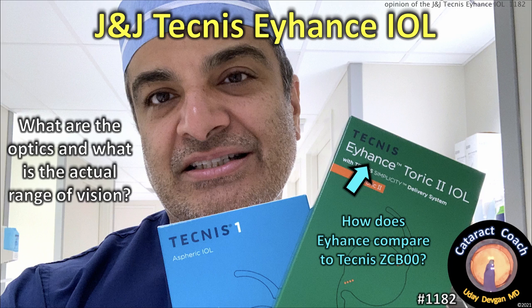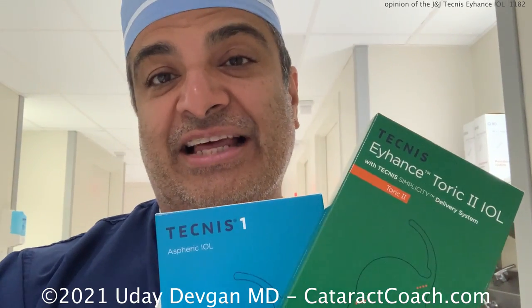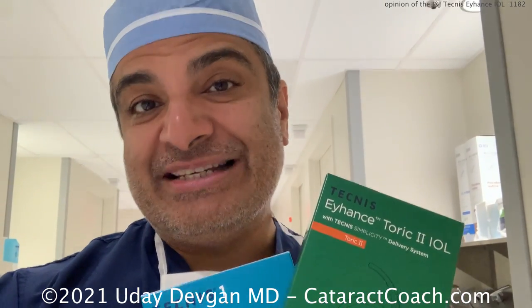CataractCoach.com — the J&J Tecnis Eyhance IOL. What are the optics and what's the actual range of vision? Tell me about the Tecnis Eyhance and how it varies or differs from the regular Tecnis lens. Here are the two lenses — let's give you the breakdown.